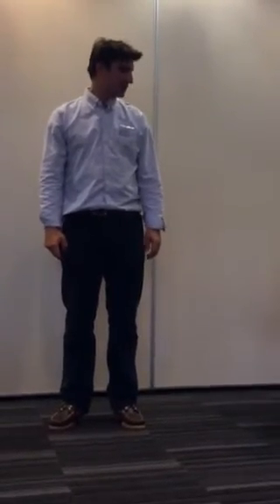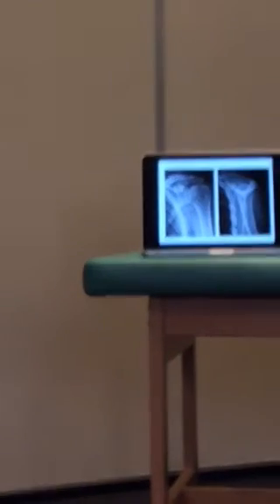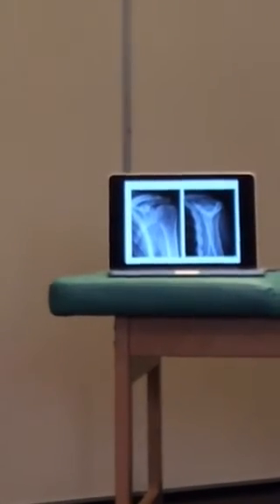The sum total of fuck all. Okay, it doesn't tell you anything. Simple test, you can do it there and then, and you can look it up. X-ray, okay? So send him for an X-ray, and then you get this. So effectively this X-ray is normal, all right?